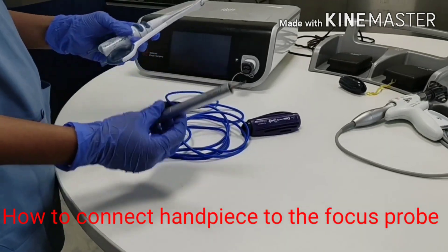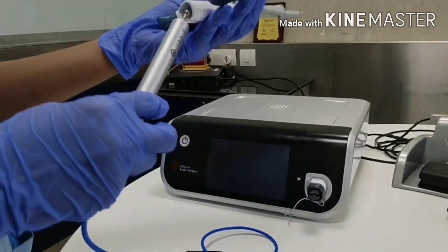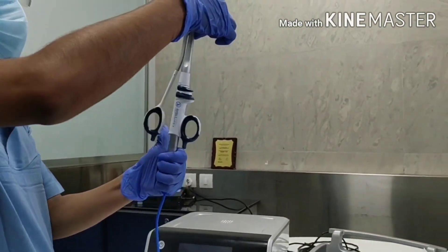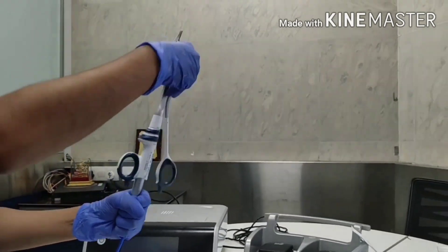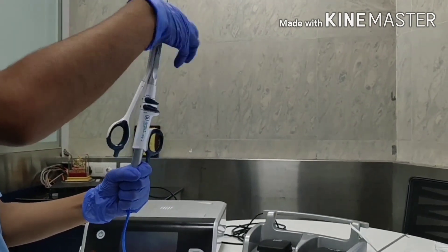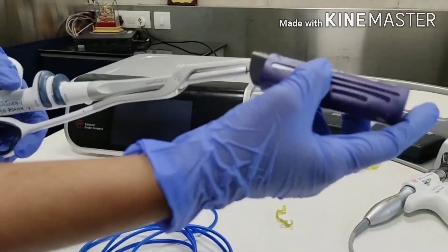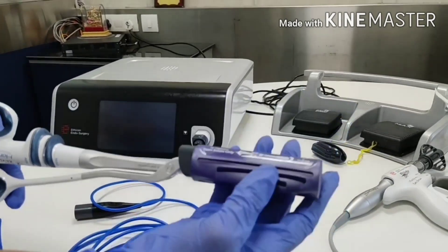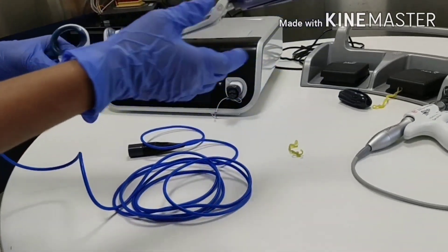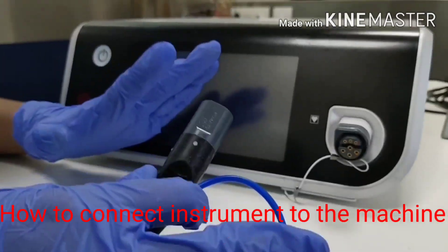This is the open surgery probe and its focus handle — that is the open surgery transducer. Insert here, hold the transducer, and rotate the probe. It's tightened now. Introduce the key inside — this is the tighten key for the open probe — and rotate two times. Two clicks are enough to tighten the assembly.